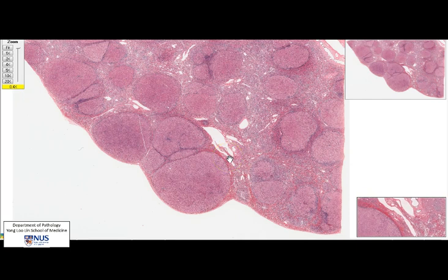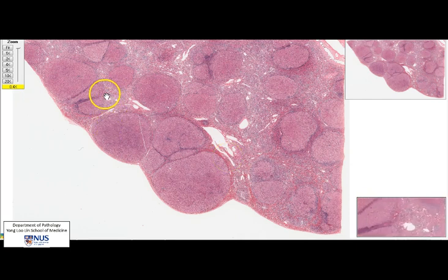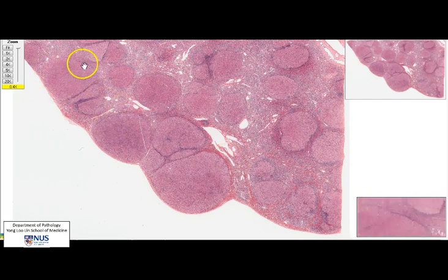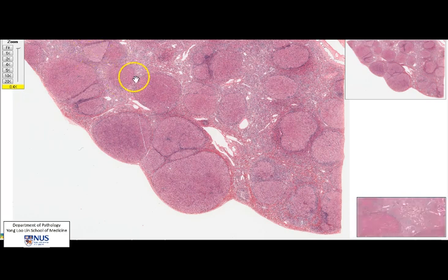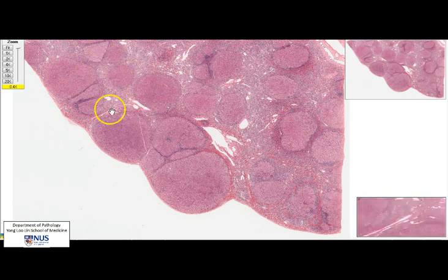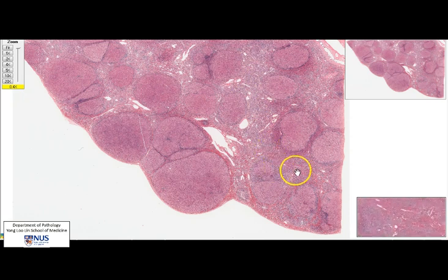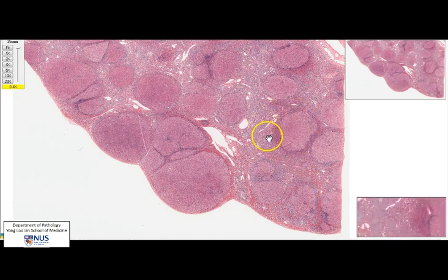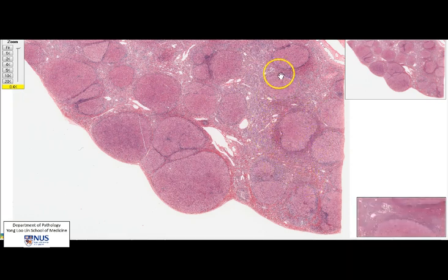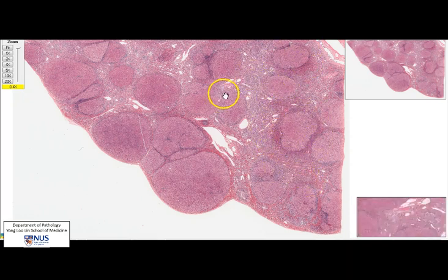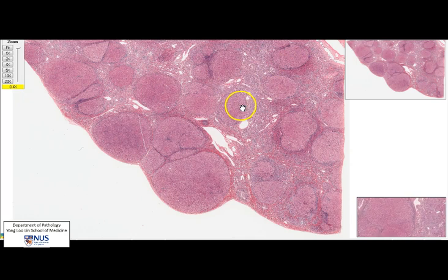Here is the virtual slide of a case of cirrhosis, and again at low power you can appreciate the nodularity. You can see that there are some areas in between which are the septa, which appear a little bit different from the pink hepatocytic regenerative nodules.